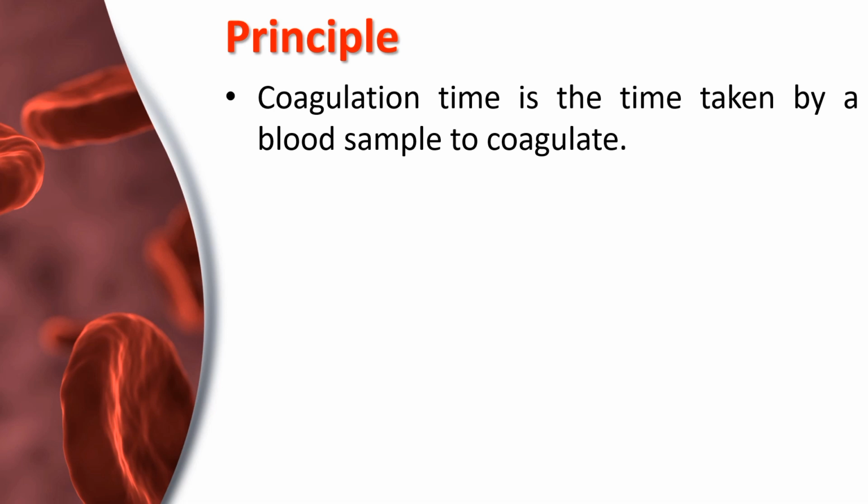Whenever a blood vessel is ruptured, a clot is formed. So, the clotting time is said to be the time period between the appearance of blood and the evidence of formation of the first fibrin thread.